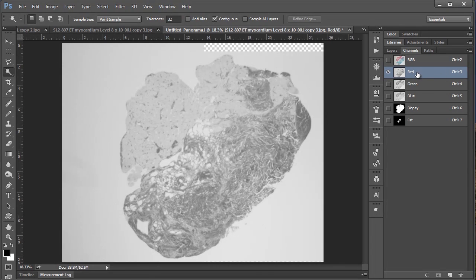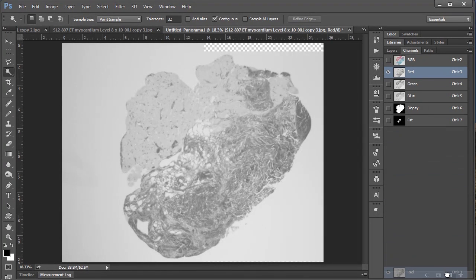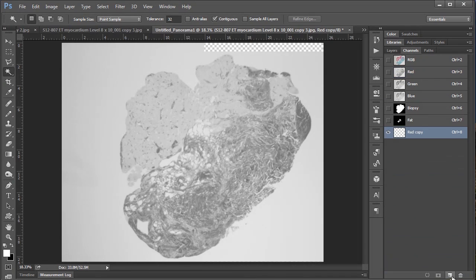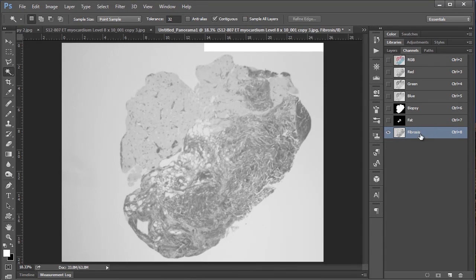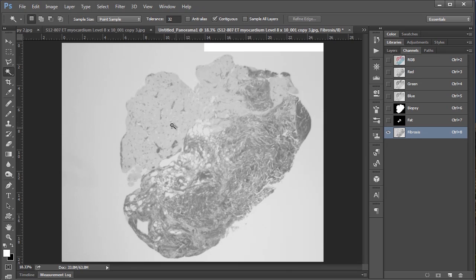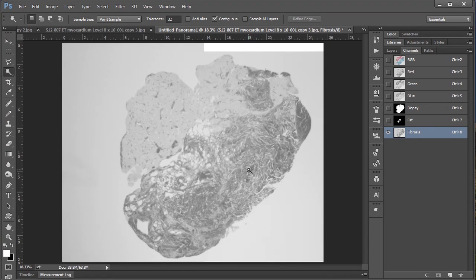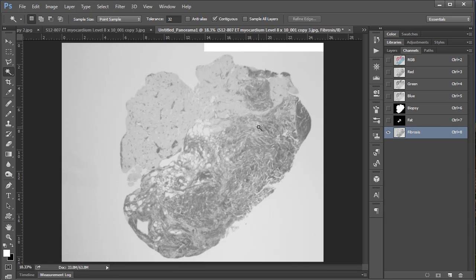So what we want to do is take this red channel and drag it down to the new channel icon here, the new page. And that's going to create a copy of the red channel, which I'm going to rename to fibrosis. And so what we want to do basically is to convert this to a completely black and white image like our other two selections here, with in my case the fibrosis being white and everything else being black. So I will have to invert it after, but basically we just want to isolate this from everything else.